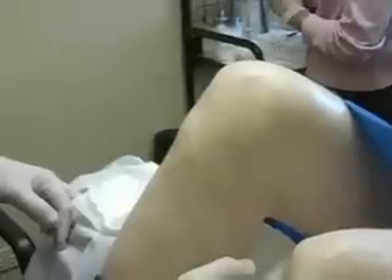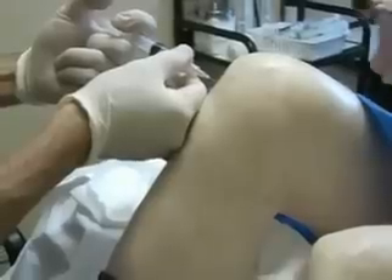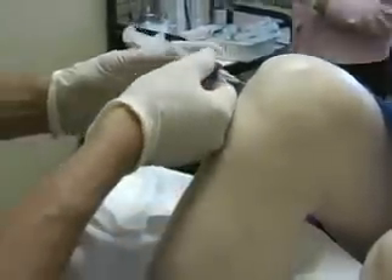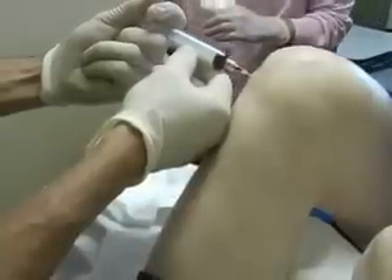This video shows an actual PRP — platelet-rich plasma — prolotherapy procedure. What you'll notice is that the patient also received Hemwall-Hackett prolotherapy. Here I'm anesthetizing the inside of the knee with some anesthetic. This is needed because platelet-rich plasma does cause a lot of inflammation, so this will make it more comfortable for the patient. After this, I'll inject the platelet-rich portion of the person's blood, which has growth factors that will initiate a healing cascade inside this person's knee. We'll often use this when folks have articular cartilage or meniscal injuries within the knee.